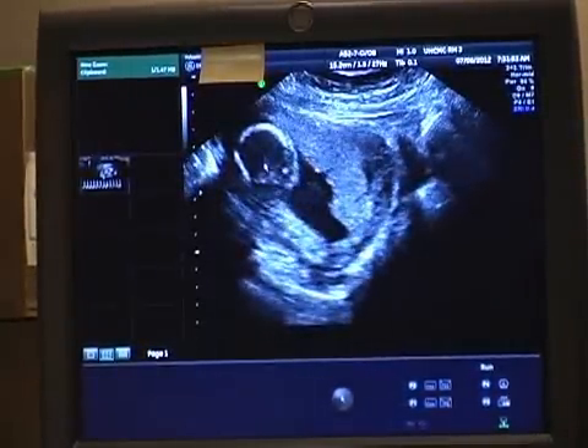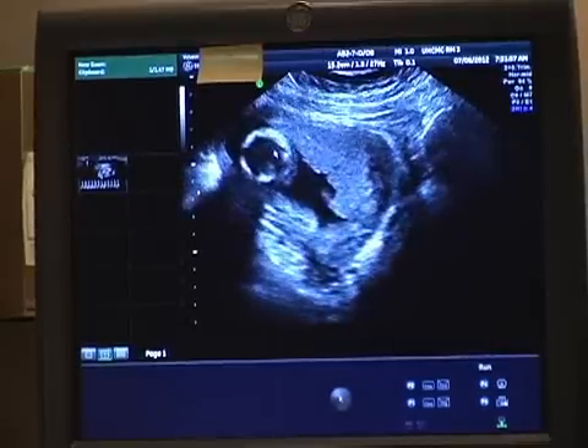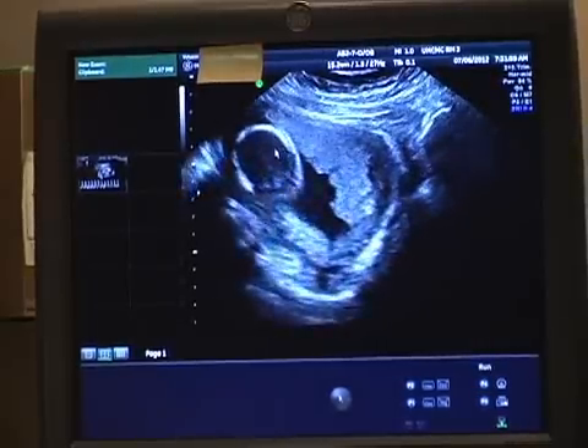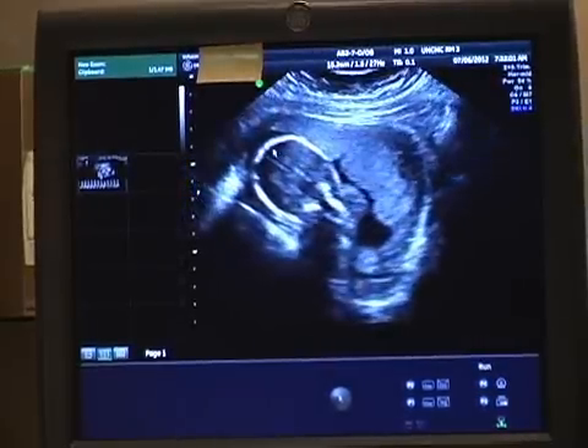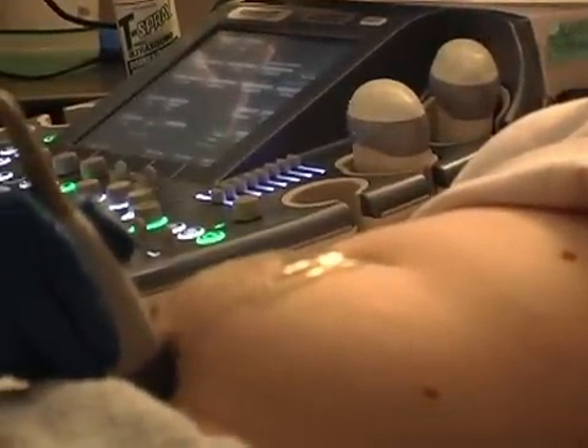Now when I look up a little higher, I see a head, and it's very tempting to say, oh my goodness, this baby must be coming head first. But let's do a little bit more investigation. So again, I have my probe oriented in a sagittal plane to the mother, with the marker toward the mother's head.